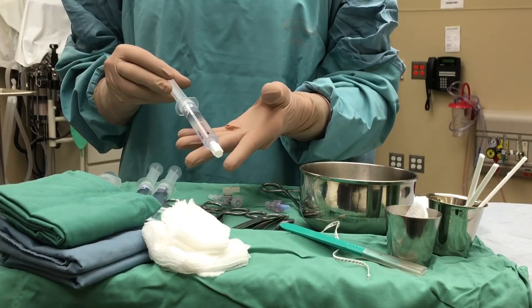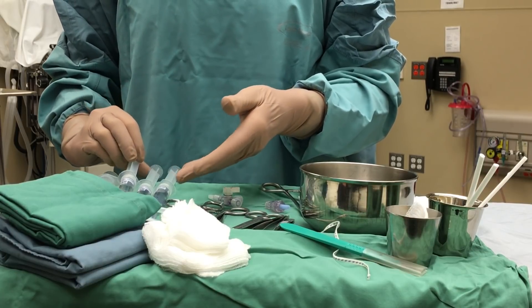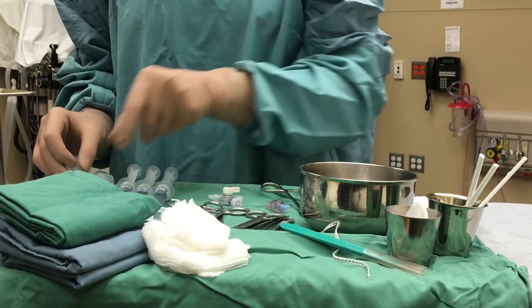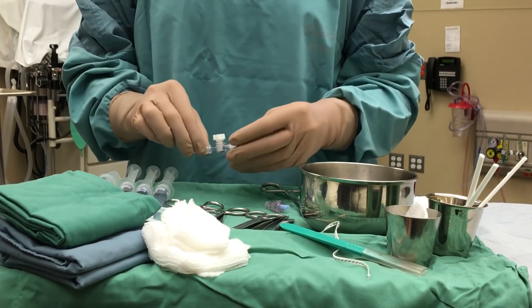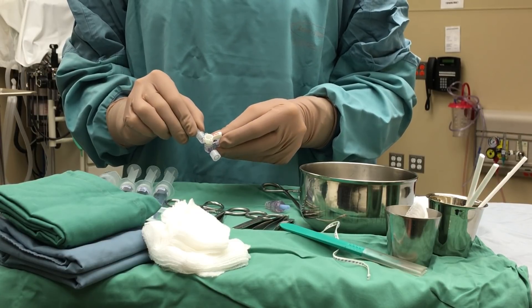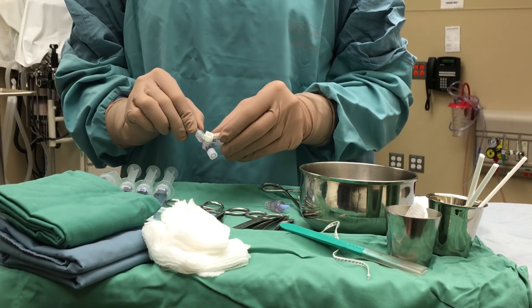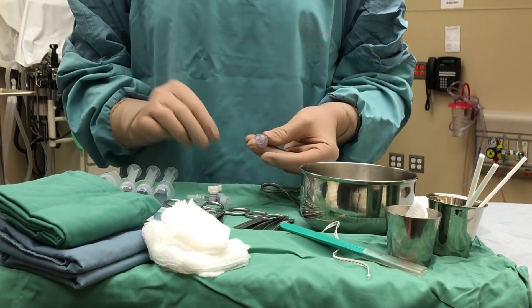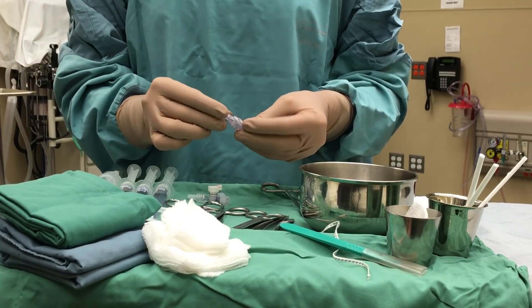We will have sterile normal saline flush, which is required to flush our lines. We have various syringe sizes depending on your preference. Along with that, we'll have a three-way stopcock, which is used for the setup for the umbilical catheters for a UAC insertion. We also have a needle-free IV adapter or connector, which is used often in our UVC insertion process.